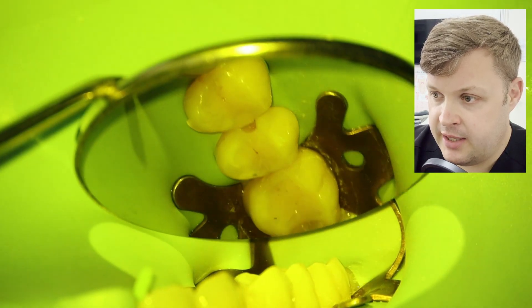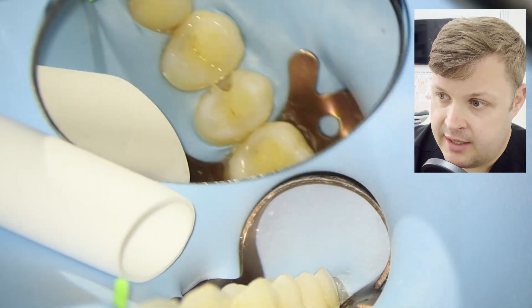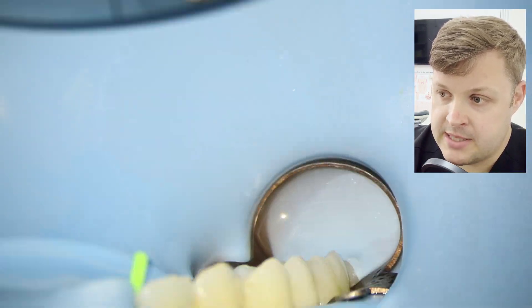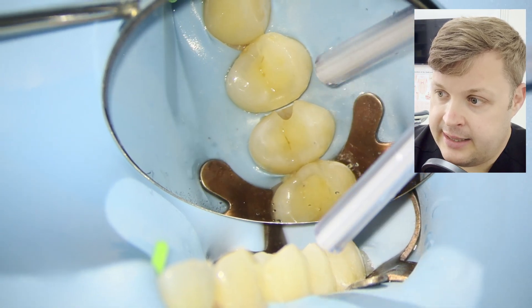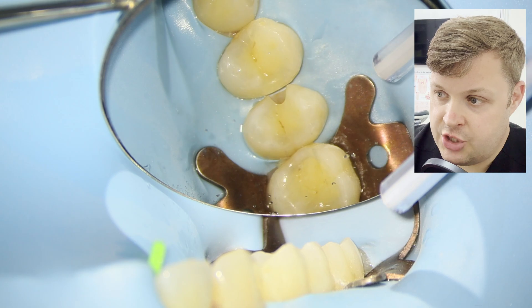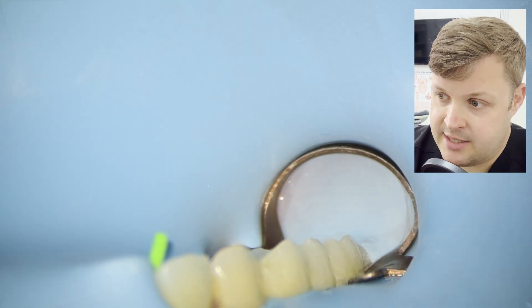I'm just light curing here, then removing the matrix band. You can see there's a little bit of flash — some of that is composite and some is bond — and we've cleaned it up. Now we've got a really nice surface for our sectional matrix to push against.